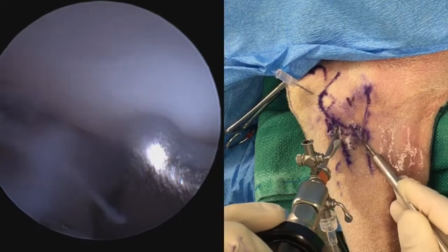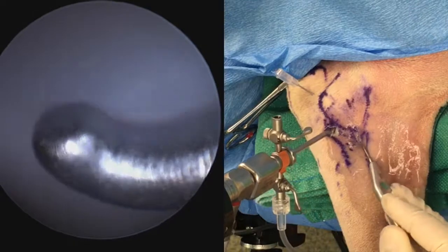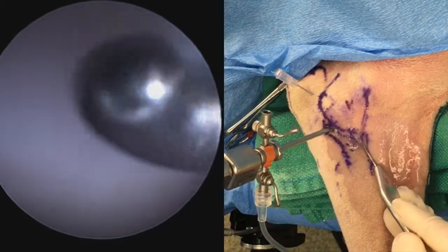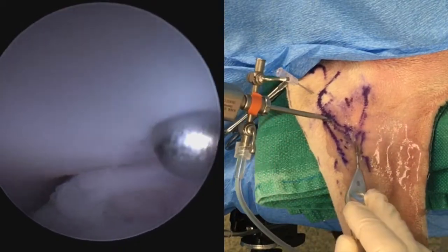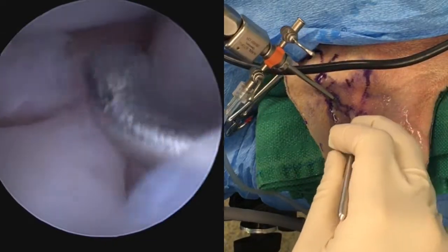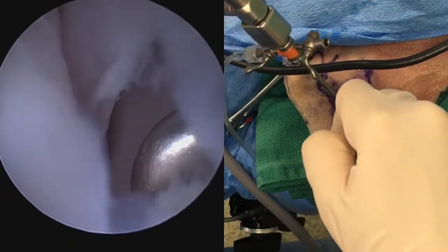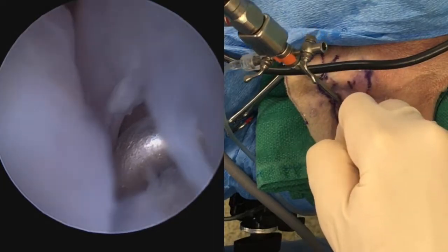You can also palpate the medial humeral condyle, where we would find OC lesions or any kissing lesions that may occur concurrently with fragmented coronoid process. Just medial to the tip of the coronoid, you should find the medial collateral ligament running from up to down, and just medial to that is the intra-articular biceps tendon.